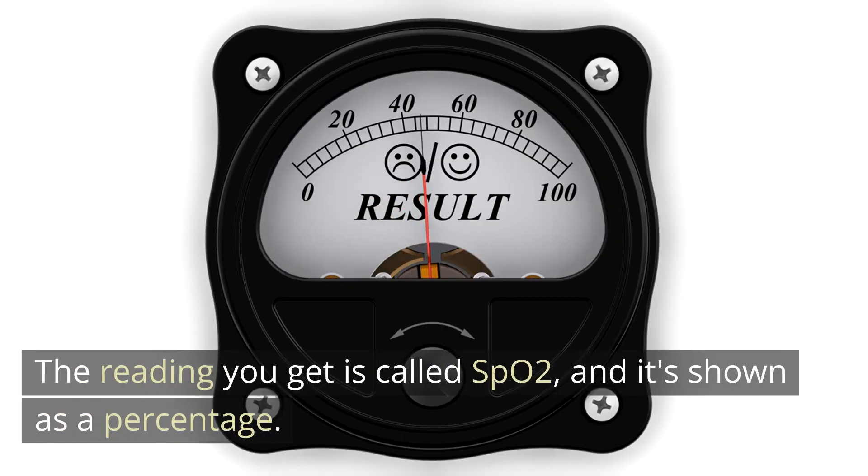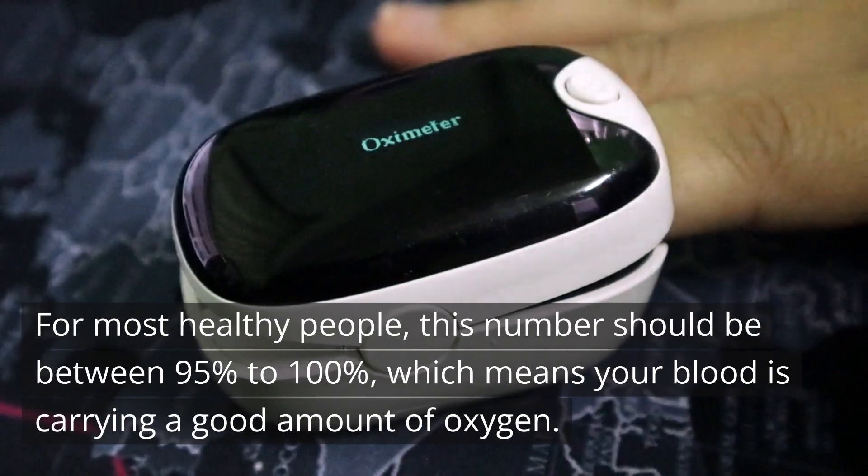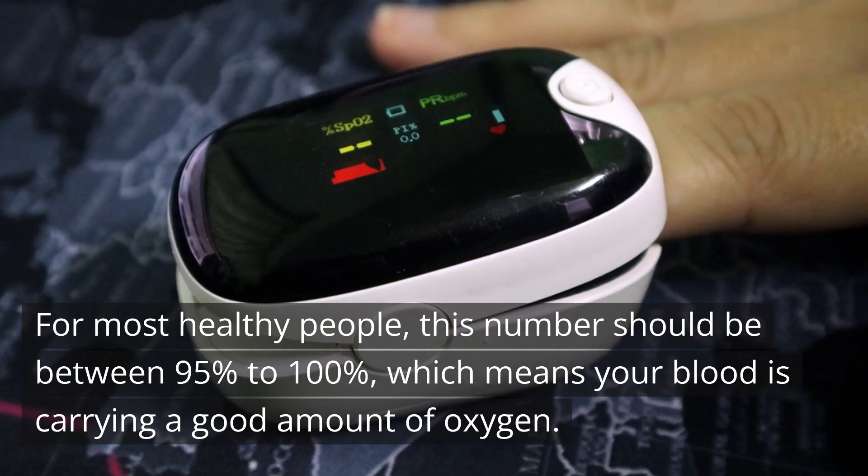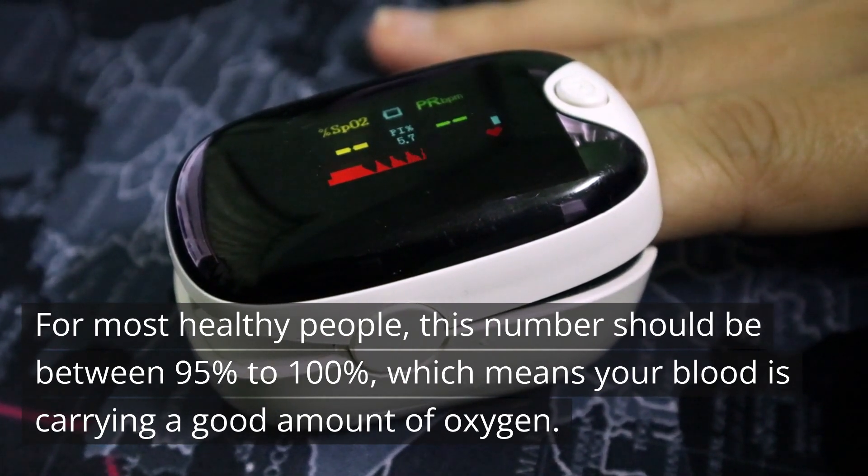The reading you get is called SpO2, and it's shown as a percentage. For most healthy people, this number should be between 95% to 100%, which means your blood is carrying a good amount of oxygen.